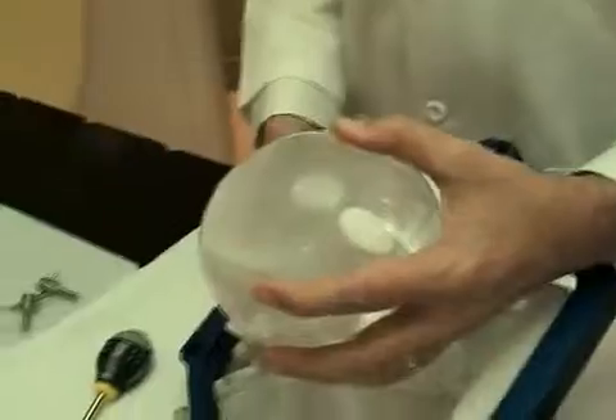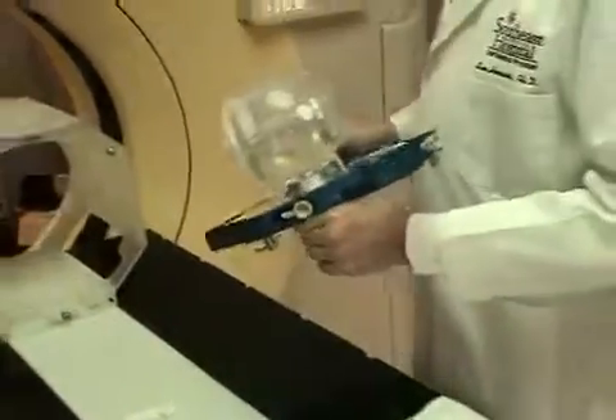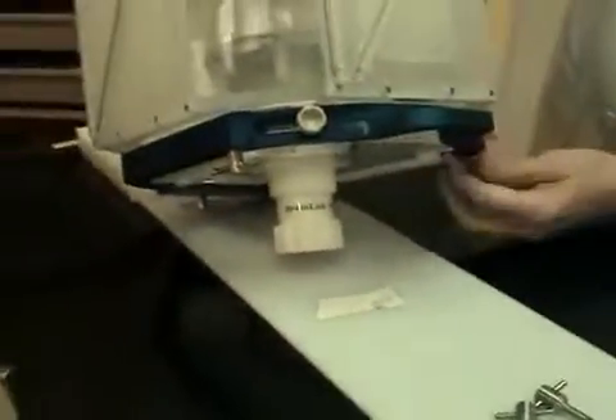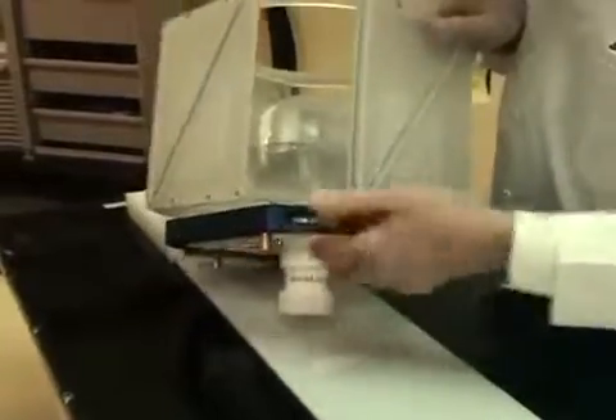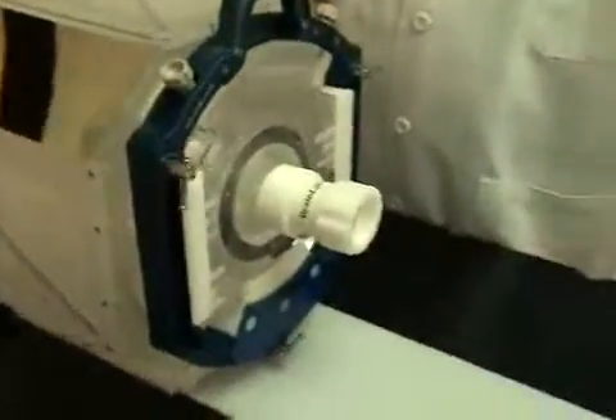The phantom is now attached to your head frame and it can be attached to your localizer box with the fiducial rods that are used for your CT scan. Once aligned in the phantom for your CT scan with your localizer box, you can import that scan into your treatment planning system, fuse it with your MRI scan, do your contours on your MRI scan, and you're ready to plan your treatment.